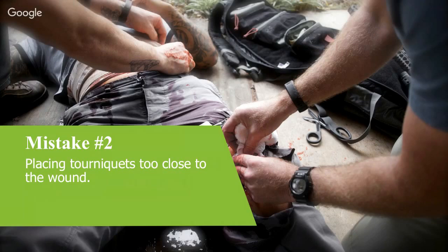Yeah, so from Liz there, just talking about how long you can leave one in place. We're cognizant of time, and we might move on. But Liz, broad brush, the TCCC committee recommends revising it within 2 hours. There's data to suggest 6 to 8 hours before you'll definitely injure a limb. But certainly 2 to 3 days as a remote medic, way too long. If you've left it in place over 6 hours, it needs to be removed in a surgical facility where you can monitor the casualty for fear of all the waste products that have built up in that limb getting released into the system, particularly potassium, and possibly causing cardiac arrest.